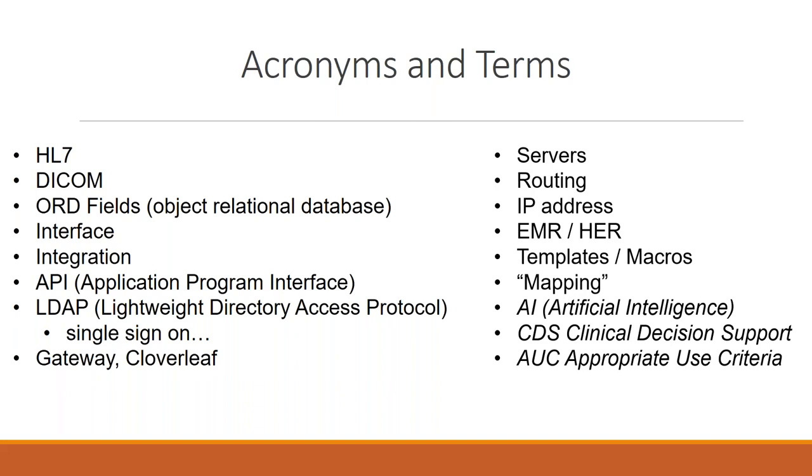EMR, EHR, we know those acronyms. Templates and macros, those are referring to your voice recognition systems. Very powerful. If the doctors aren't using them today, try and get them to embrace them. If they are, like most practices, about 60% of all imaging is negative studies. And if they have a template or a macro for that, it's as simple as saying "chest x-ray negative" for the macro, and it will pull up all of the wording and all the verbiage and set it up for them to sign. They have a one click and off it goes from the RIS back to the portal into the EHR. So if they're not using them, try to get them encouraged to do so.